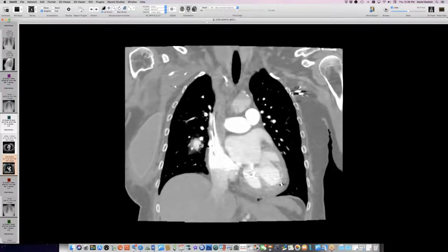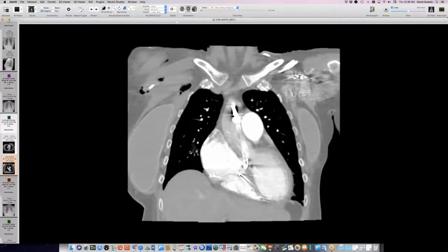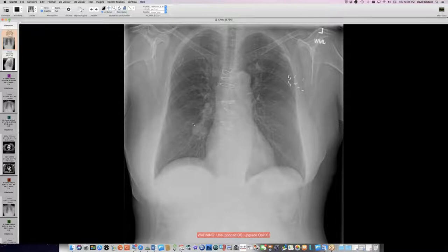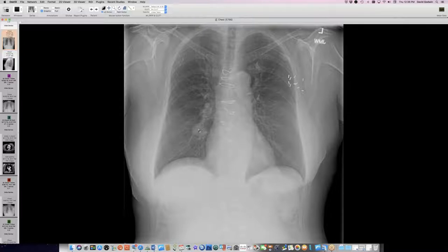We have this round lesion which fills nicely with contrast — this pulmonary artery pseudoaneurysm. The pulmonary artery balloons like that and then tapers off into normal caliber. This thing emerged back in June and this is the current imaging — now October, just a few days ago — and we still have this very discrete round lesion. So a persisting pseudoaneurysm. It seems to me it's very dilated and there's a risk of rupture, so they would want to do something about this.